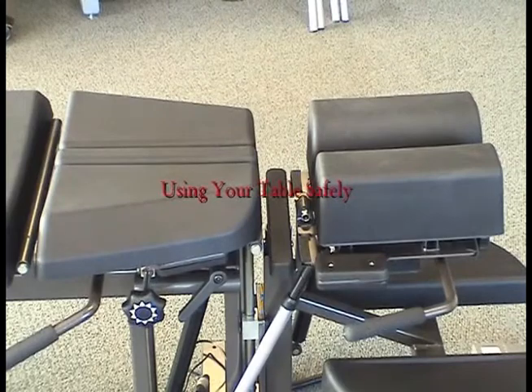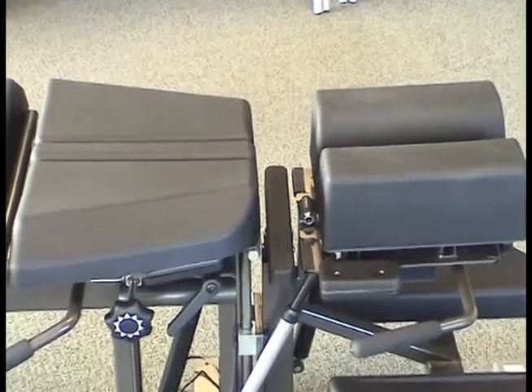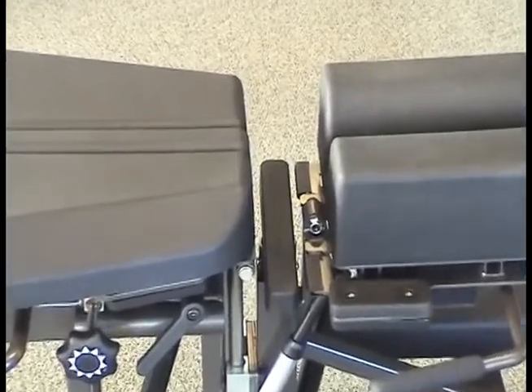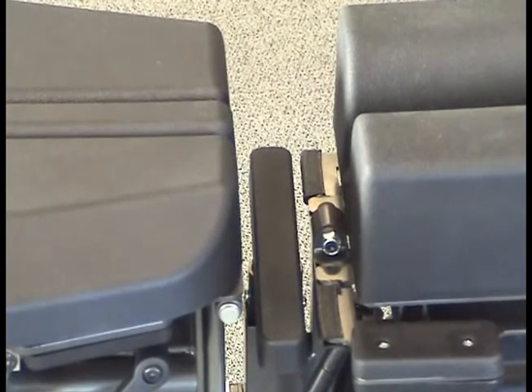How to use your table safely. It is expected that the chiropractic practitioner using a PCT table is trained and qualified to use such a table in a responsible and safe manner. PCT is designed as cervical instrument adjusting fulcrum option on its table. This option was designed for the sole purpose of postural correction using the impulse adjusting instrument. It is necessary to use caution when raising and lowering the cervical instrument adjusting fulcrum.